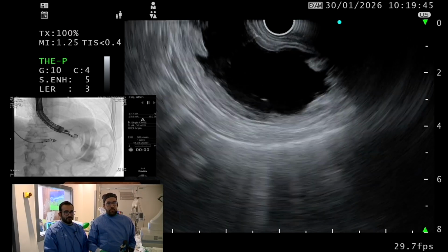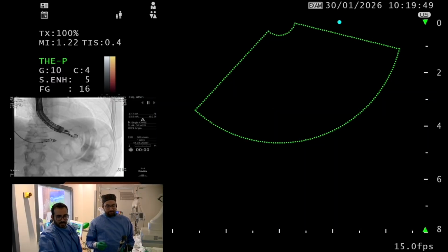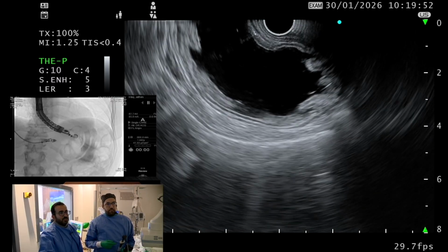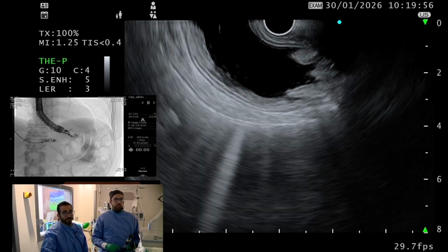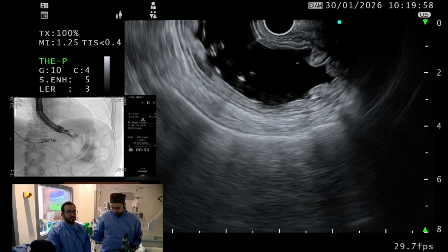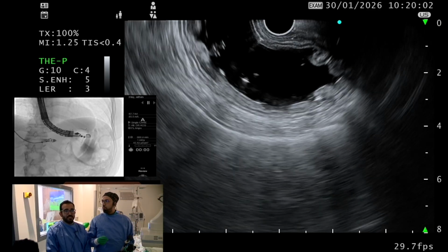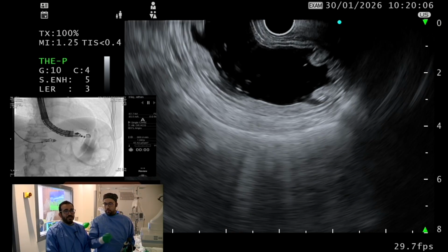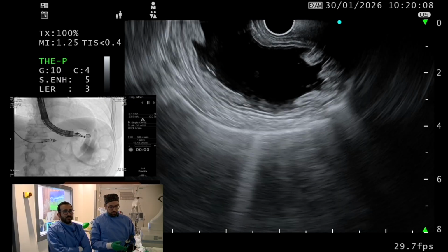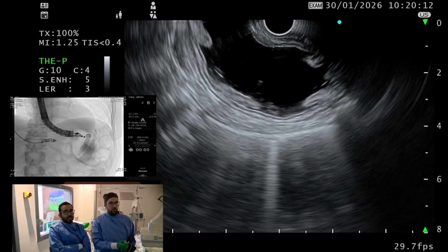So, Adel, in this case, you would go for two stages, right? Because there is no urgency to assess today. Absolutely. The patient has no cholangitis or impending cholangitis, so it's just an assessment of a distal stricture. So we'll just do the lumen-apposing metal stent stage using a Hot Axios 15 millimeter diameter. As we know, the 20 millimeter is now out, which is another reason to do a two-stage approach.